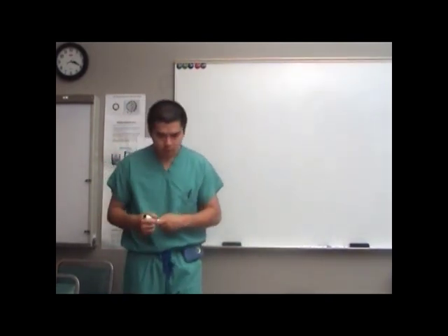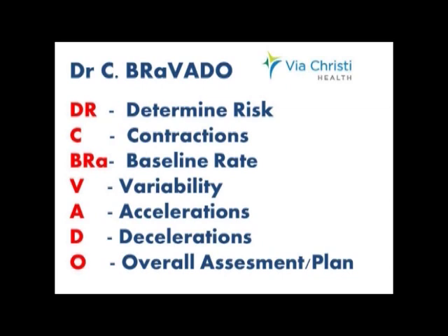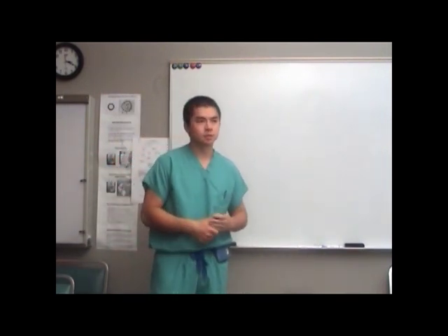The next thing is, they also teach you the Dr. C. Bravado mnemonic. You can use that if it's helpful. I don't really use it, but always have a set pattern that you go through so that you don't miss things. The first thing on the Dr. C. Bravado is determine risk.